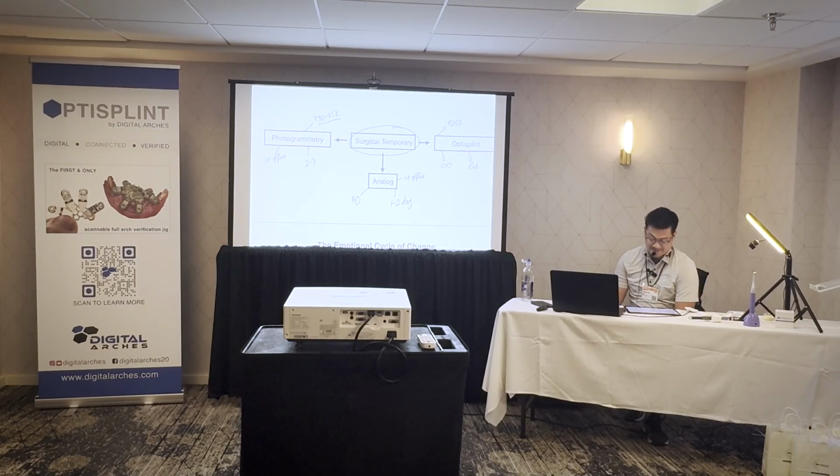In terms of time, how long does it take you to do a conversion? Like the easiest one? 3 hours, 2 to 3 hours. 2 to 3 hours. Yeah, that's about right.